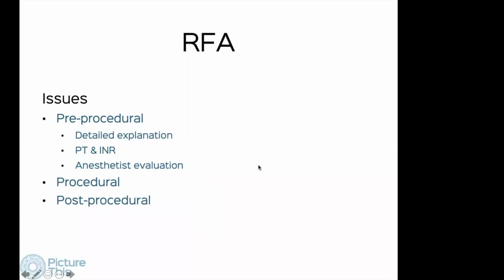Now, all patients with osteoid osteoma who come to us are evaluated for the possibility of radiofrequency ablation. Usually, only when the lesion is in the spine and close to the cord or the nerve root do we not do the RFA. Otherwise, there is no real contraindication. So we will talk about the pre-procedural, procedural, and post-procedural issues.